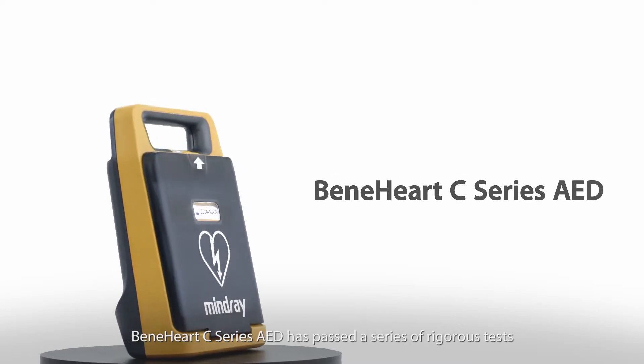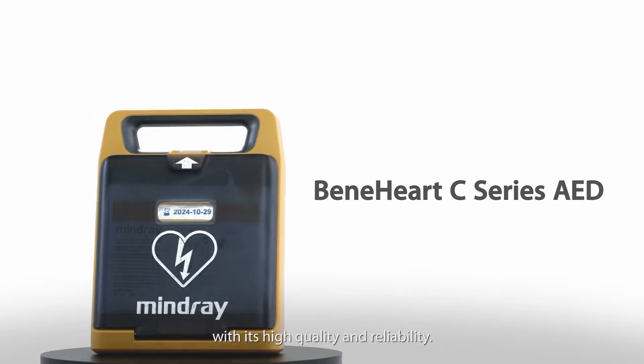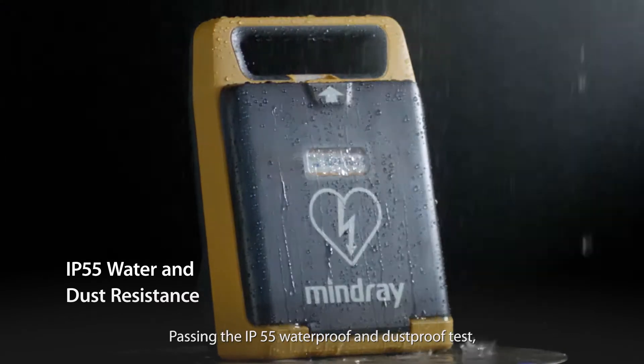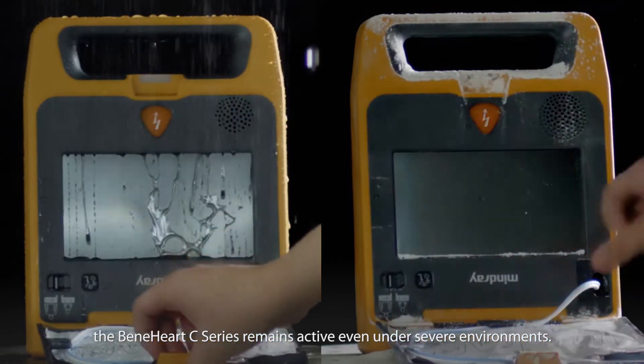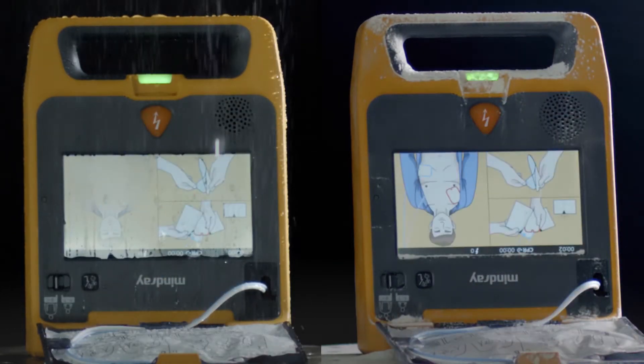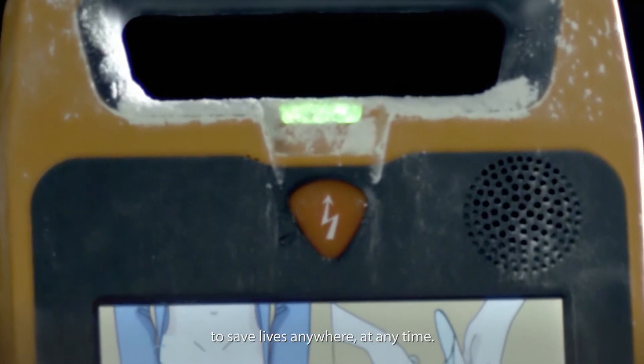The Benihart C-Series AED has passed a series of rigorous tests with its high quality and reliability. Passing the IP55 waterproof and dustproof test, the Benihart C-Series remains active even under severe environments. The reliability of the device ensures that it is on standby to save lives anywhere, at any time.